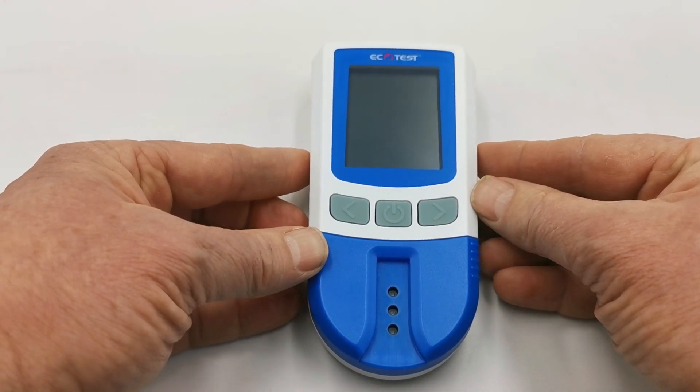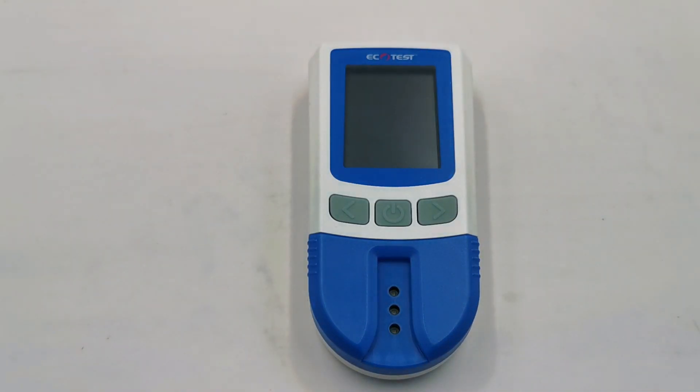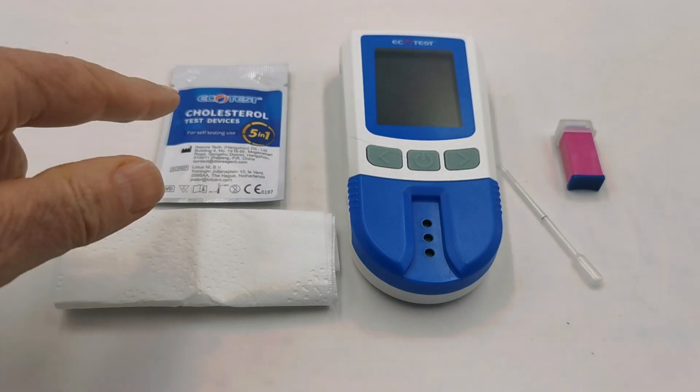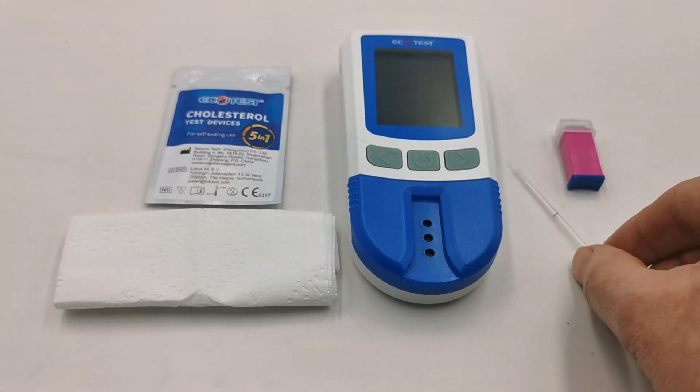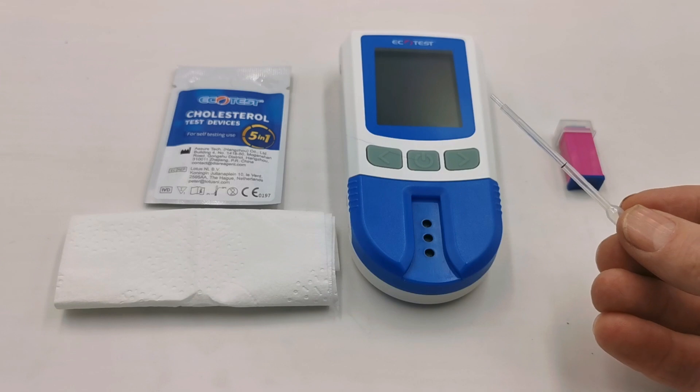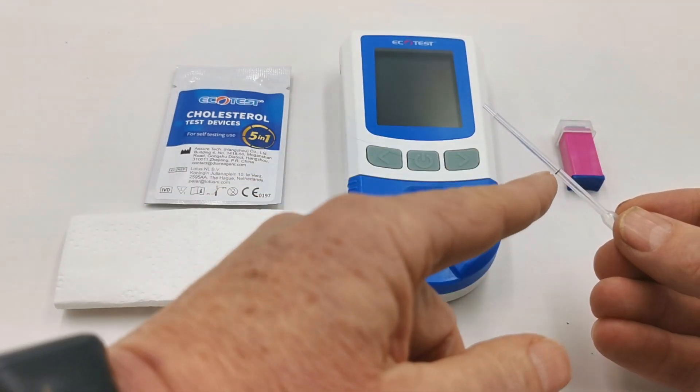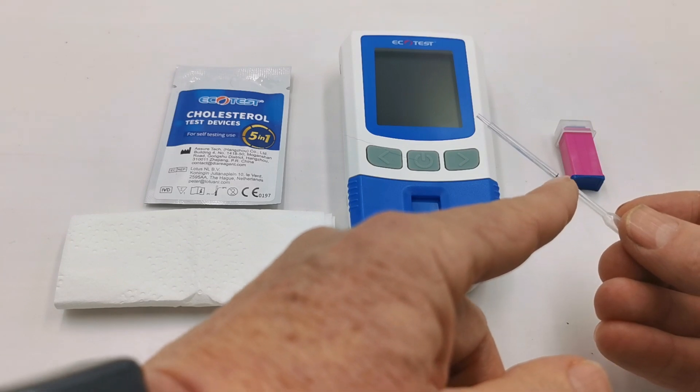You are now ready to perform your first test. The meter is set up with batteries, time, date, and the code chip is in place. Supplied with the test devices are these pipettes. They will obtain exactly 35 microlitres of blood up to the black line on the barrel.